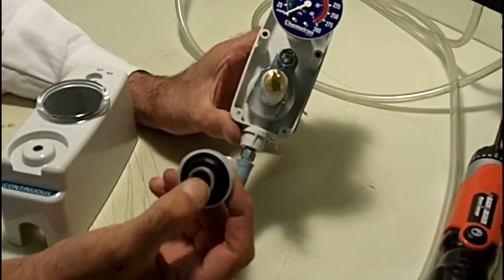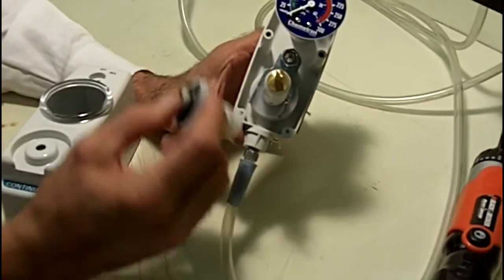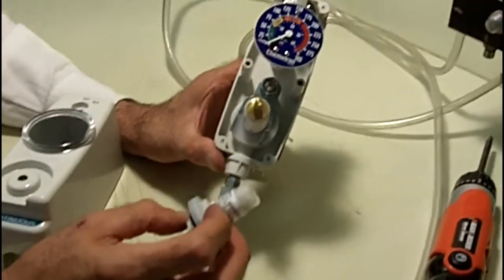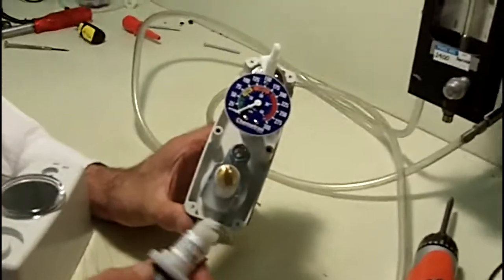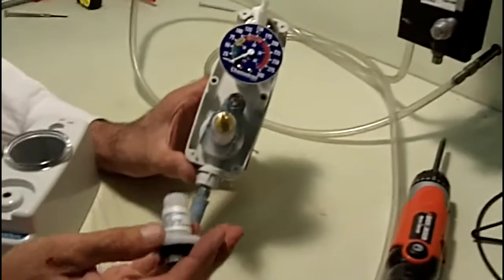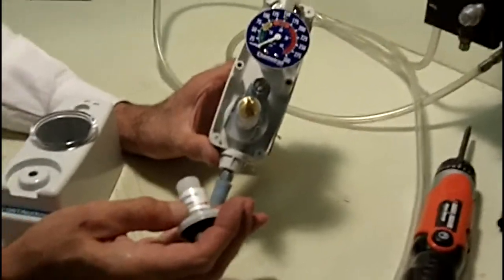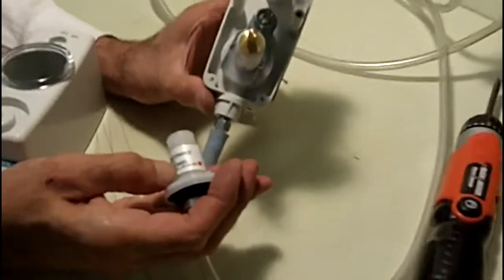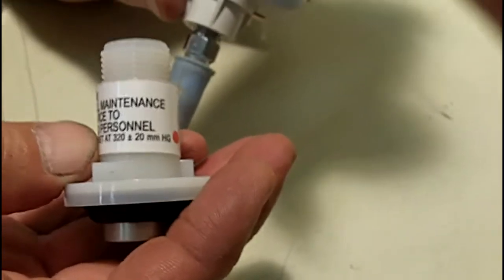We basically say at specified maximum, we should have 320 plus or minus 20 millimeters of mercury vacuum. That's what our settings are.